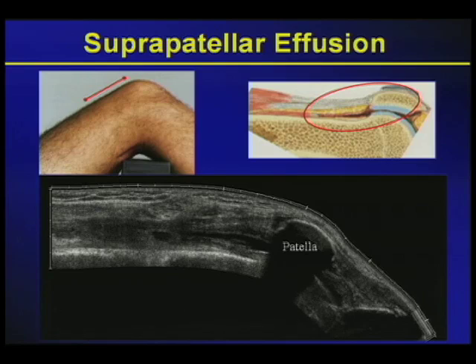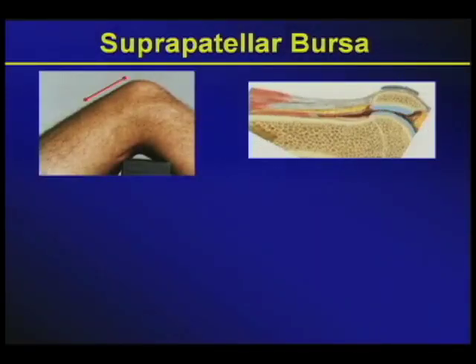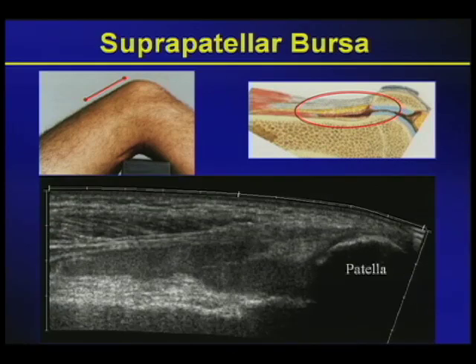Try to remember that unless you use contrast in both CT and MRI, you will not be able to see synovial proliferation. Once in a while, a case that will come across your workstation is going to be something like this, wherein now, instead of just simply having anechoic fluid behind the distal quadriceps tendon, you have something that is more intermediate echogenicity, and in this case, again, some intraluminal debris in an individual that might even represent some subacute blood.